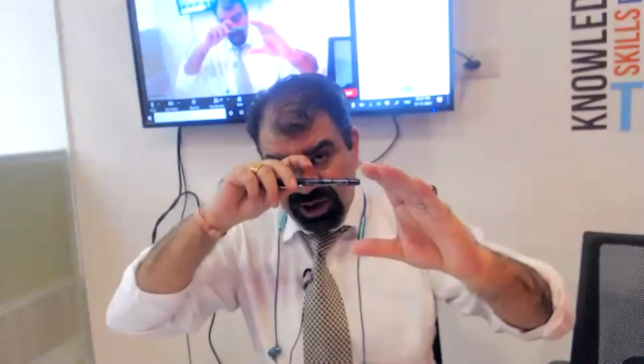Now, second important point on TVS. When I have to scan the cervix, I have to tilt the probe inferiorly, not posteriorly, inferiorly, and I have to pull it slightly out, not completely, slightly out. Then I have to angle it inferiorly. Then only I will get the cervix.